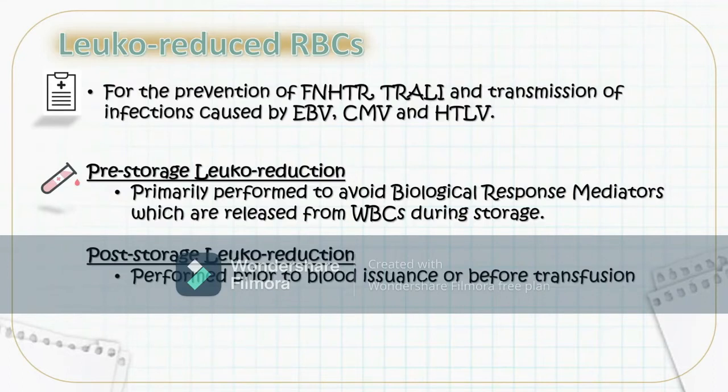However, the disadvantage of post-storage leukoreduction is we could not avoid the release of biological response mediators since the WBCs contained by the packed red blood cell unit were not removed prior to storage. So, there's the possibility that during the storage period, the WBCs contained by the packed red blood cell unit have already been lysed and have already released biological response mediators, which again results in adverse transfusion reaction.